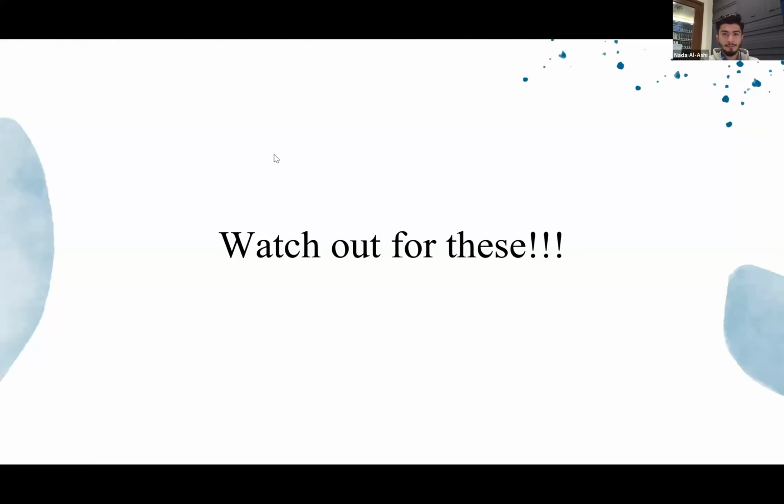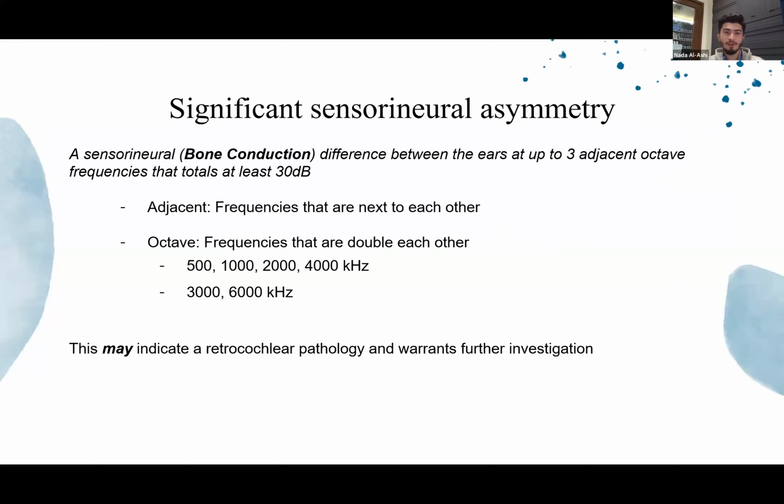So firstly, I'll go through a significant sensorineural asymmetry. So you might be wondering what that is. This is a sensorineural difference or a bone conduction difference between the ears at up to 3 adjacent octave frequencies that totals at least 30 dB.